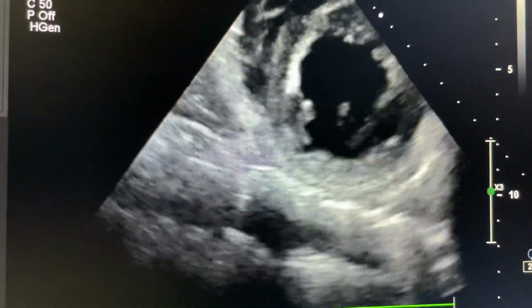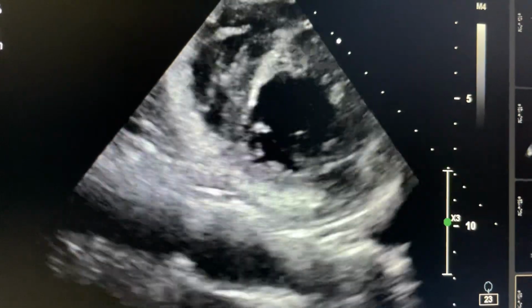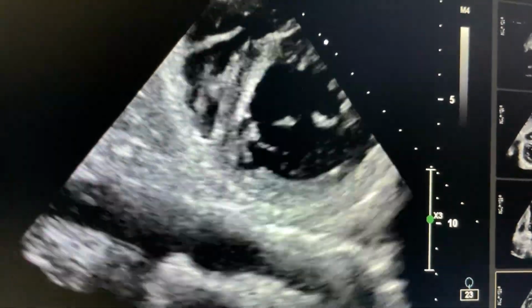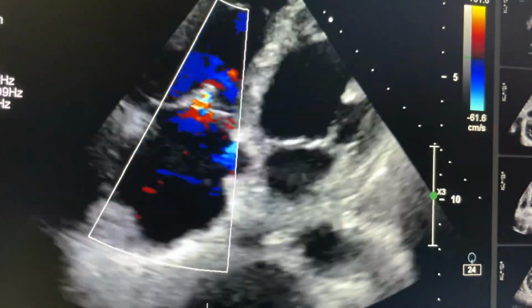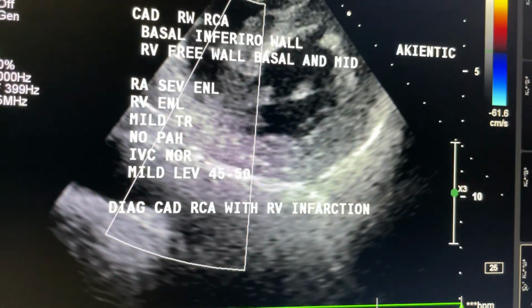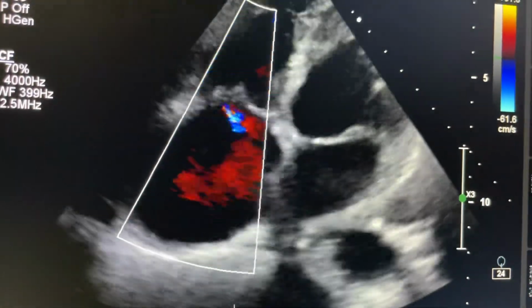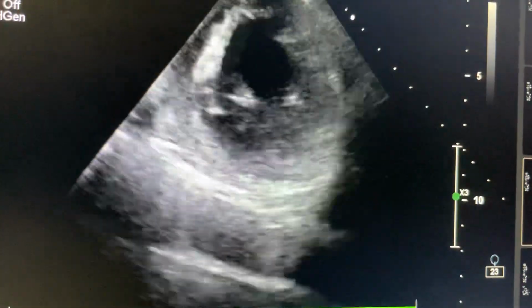Again the same thoracic aorta, along with, you can see this portion is akinetic. So ultimately in this case, you can see the minimal TR jet. So this case probably had right coronary artery blockade.